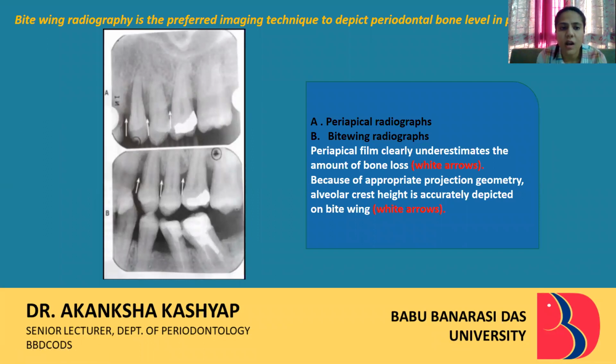So whenever you are asked which is the preferred imaging technique to depict the periodontal bone level in the posterior teeth, we should always answer the bite wing. It is always the preferred technique.